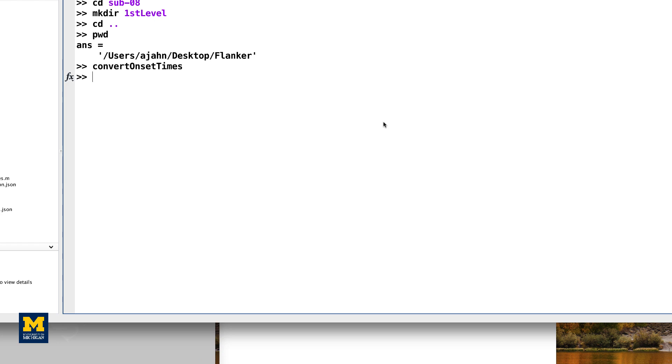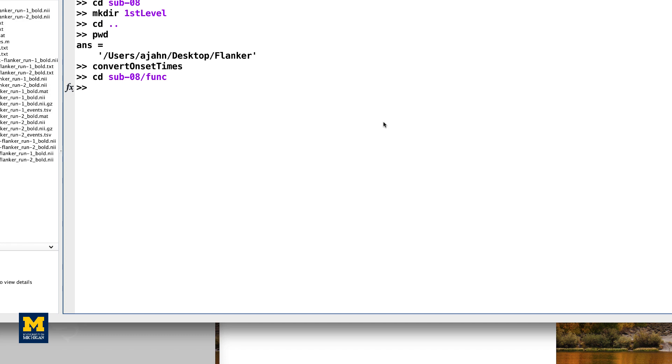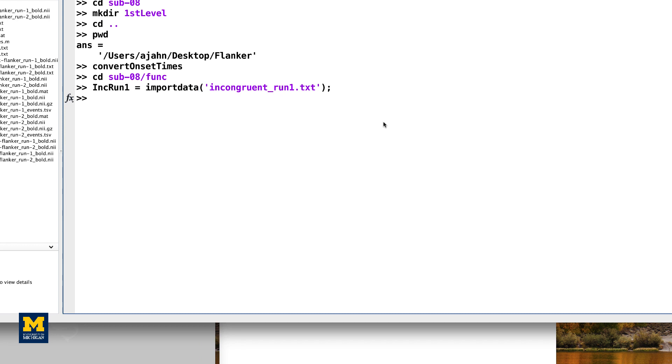When the script finishes, navigate to the directory sub08/func and type the following: inc_run1 = importdata('incongruent_run1.txt').